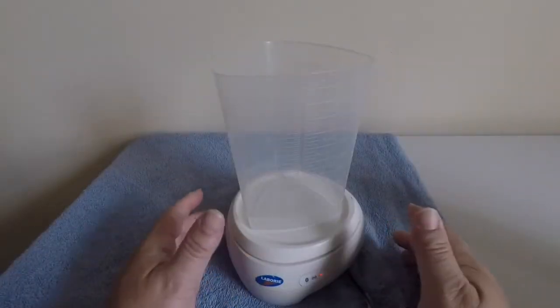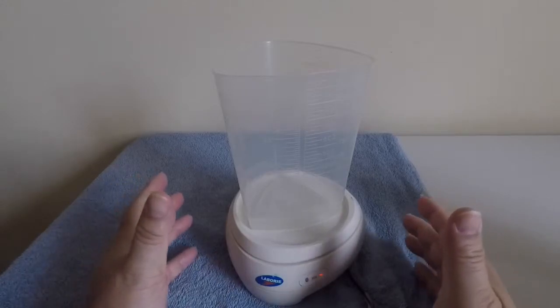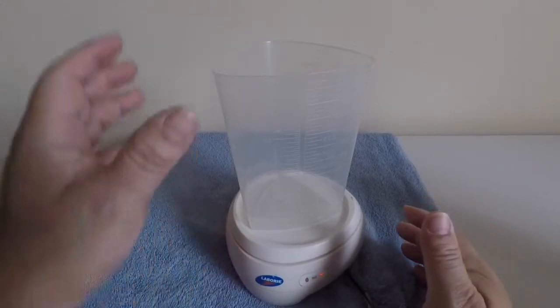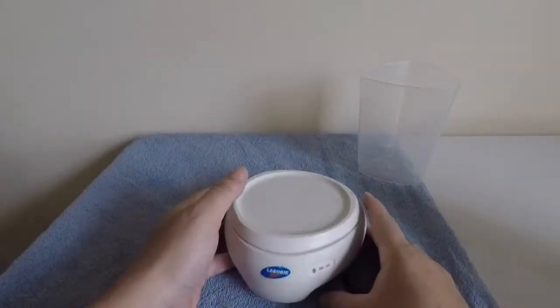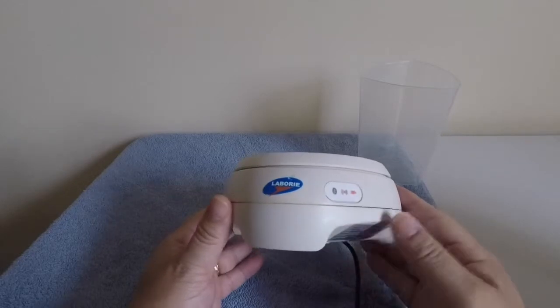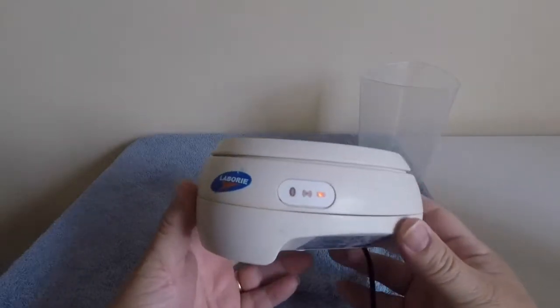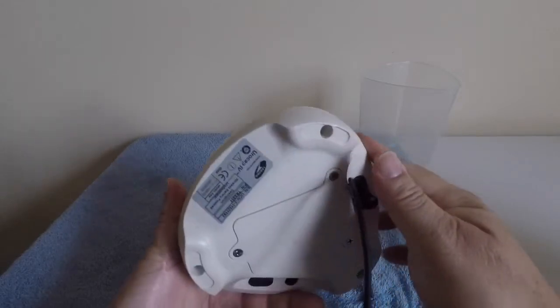Hello, this is Pete Butcher, Technical Support Manager for BHN. Today we're going to be looking at the Laboree Gobi Eurocap. The purpose of the Eurocap is to measure voiding volume and voiding flow. The unit is wireless, runs off Bluetooth, and is also battery powered.